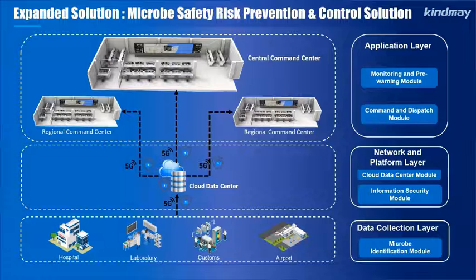And this is the network architecture of the X-Insight system. As you see here, it includes three parts. The bottom part is the data collection layer.